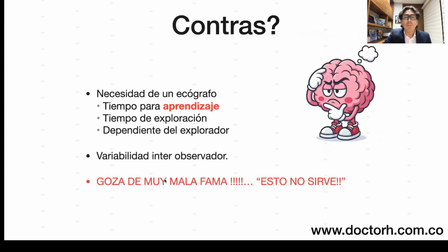We believe there are more advantages than disadvantages, but the downsides do exist. There's the need for an ultrasound machine, but nowadays these are devices you can get at a very low cost, and we literally have them in our pockets. As for the learning curve, yes, but not really. The learning curve is about the same. It's the same curve as learning MRI.